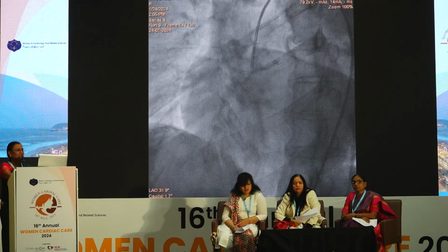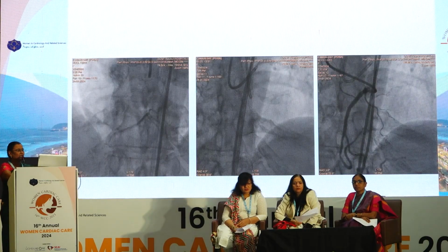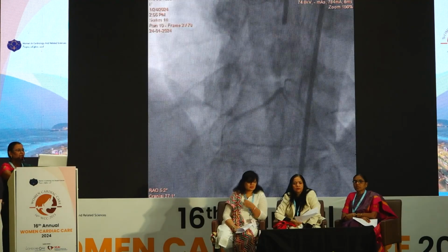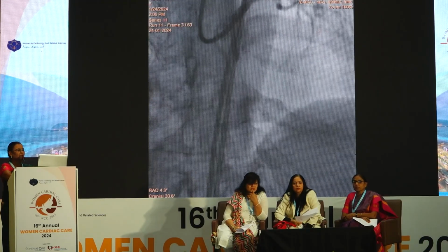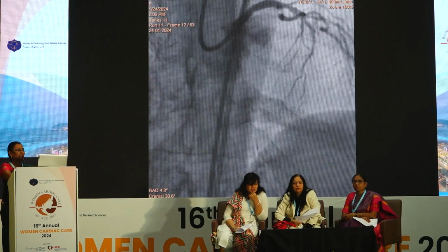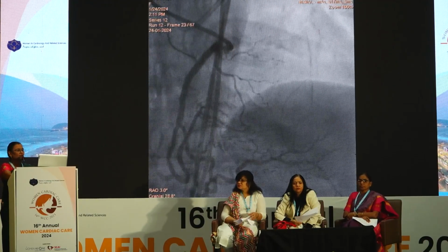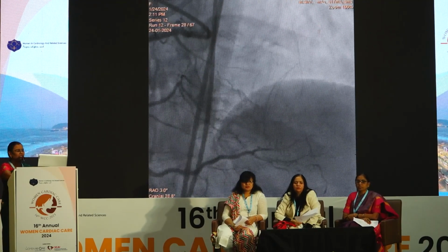With the left femoral route, we showed the course of the vessel. The left system is filling with the collaterals, and we could demonstrate the distance between the CTO segment and the retrogradely filling LAD. The dual injection is showing the segment. So after this, we further proceeded. It is more than 2 centimeters.